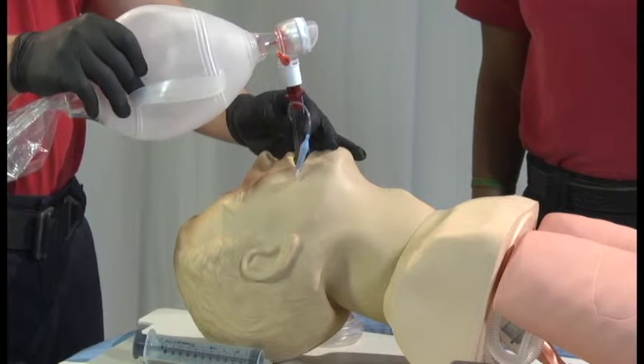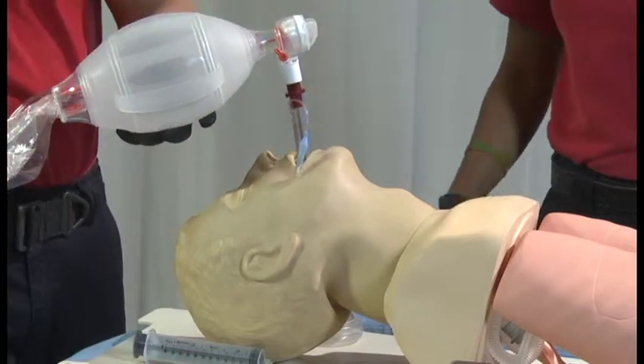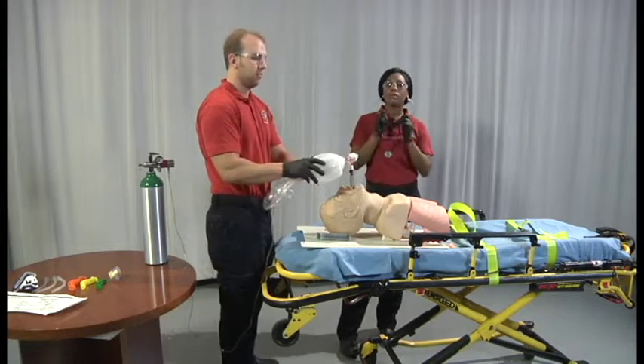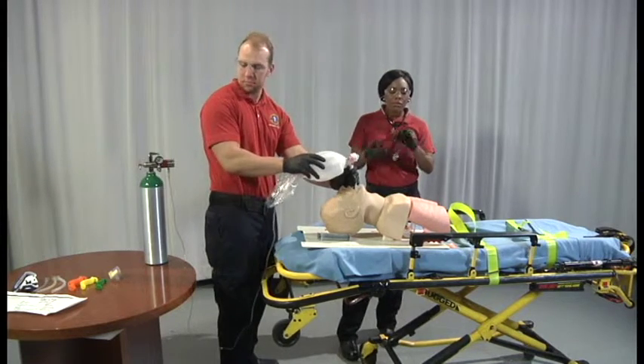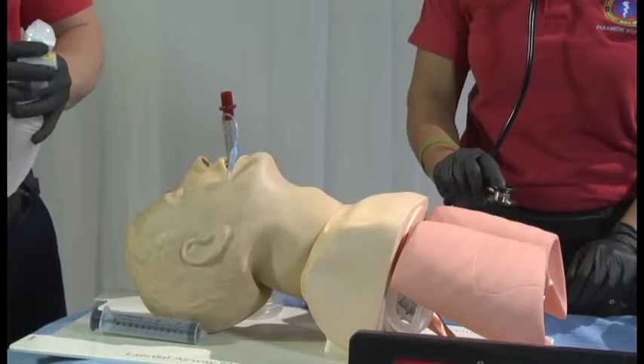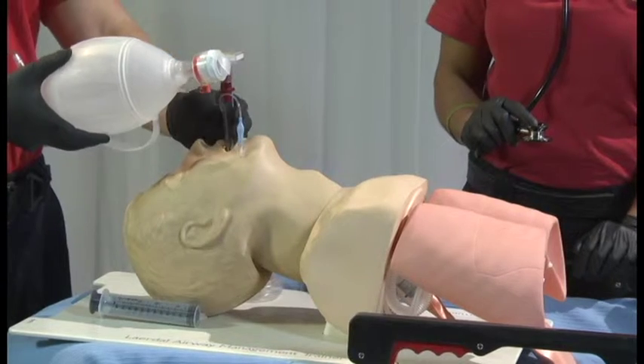Confirm proper position via auscultation, chest rise and fall, and colorimetric CO2 device. It is recommended to place the device on continuous waveform capnography to ensure CO2 and waveform throughout treatment and transport. Remember: no waveform, no placement.